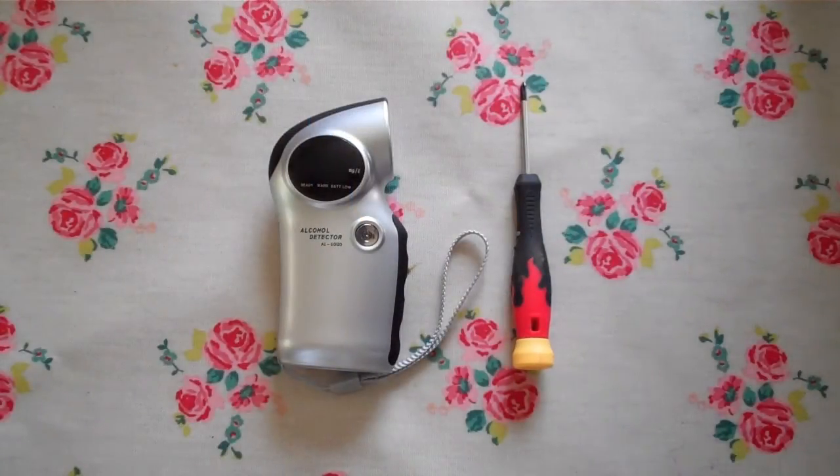Welcome to this video presentation. We're going to demonstrate the procedure for changing the sensor on an AL6000 digital breathalyzer. The only piece of specialist equipment you're going to need is a narrow bore Phillips screwdriver to loosen the casing on the breathalyzer.